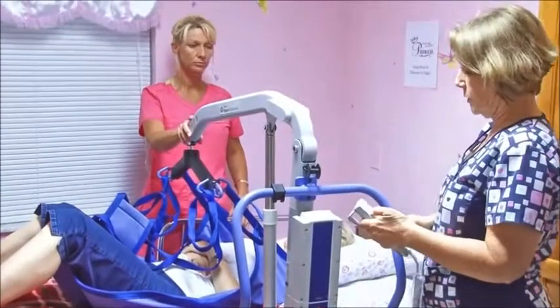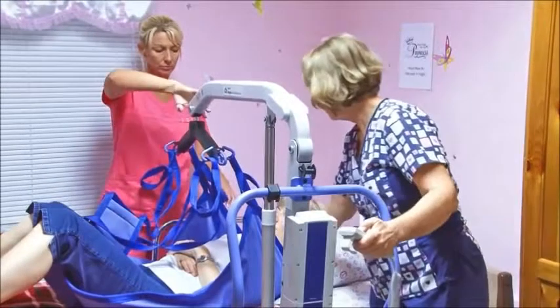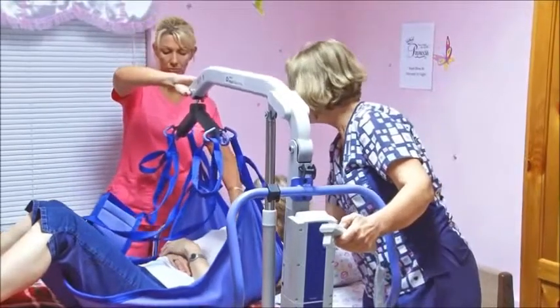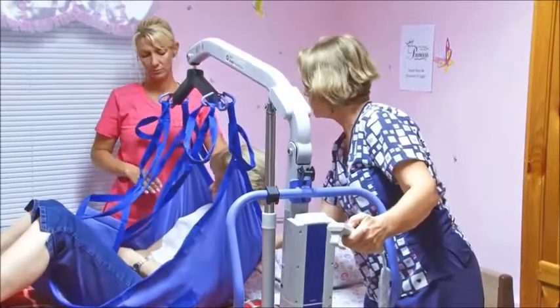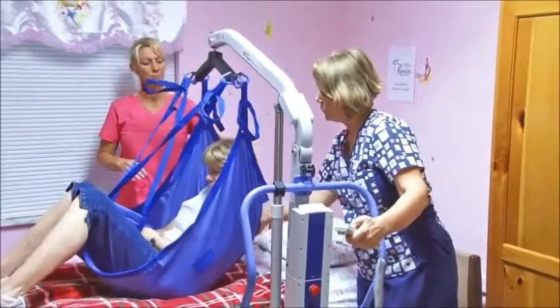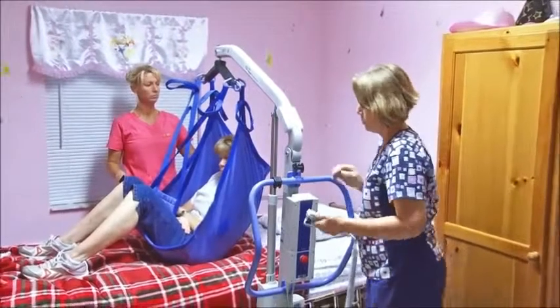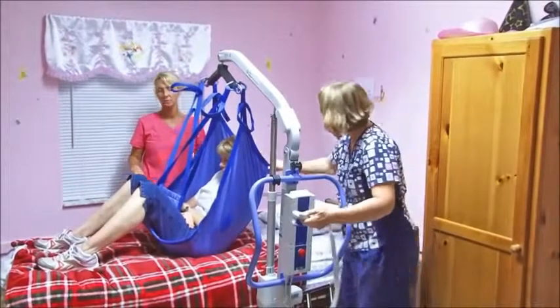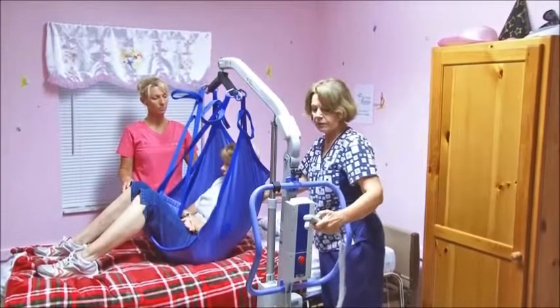Now we're going to raise. We're going to be going up now. You're going in a sling. It's like swinging, like when you were a kid. Okay. Is everything okay? We're doing pretty good. Yes. And I will continue.